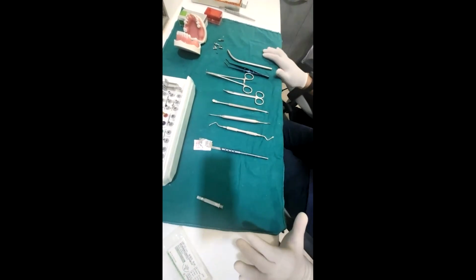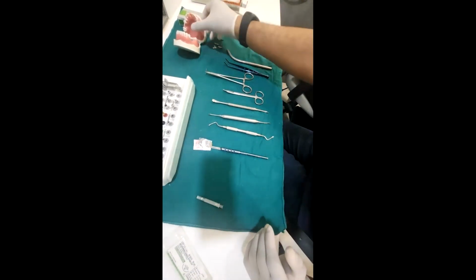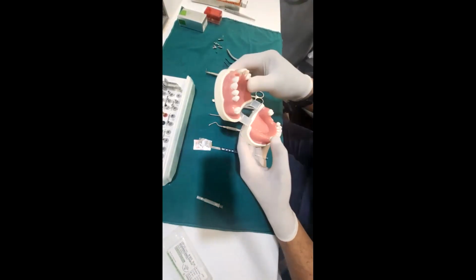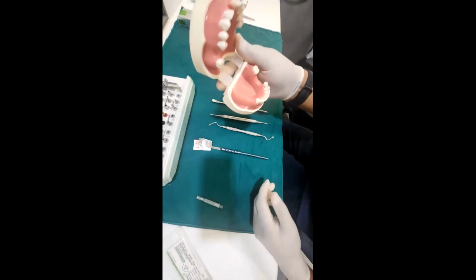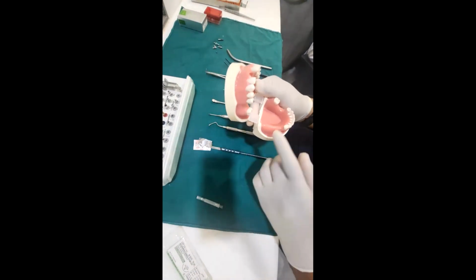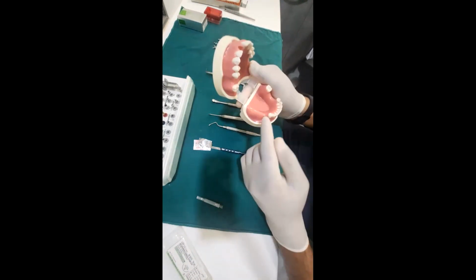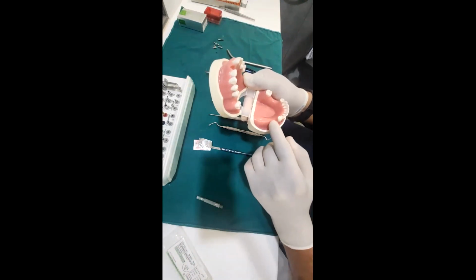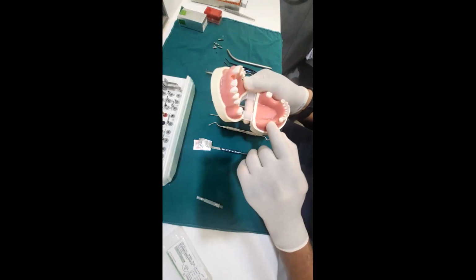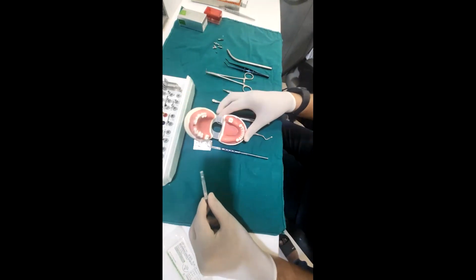So this is a typical surgical setup that we have. And here is our patient for the day. We have quite a few denture cases, sites, and we are going to plan and try to restore the lower right side, that is the 4-5 and 4-6 area. I was wanting to show this for a long time.